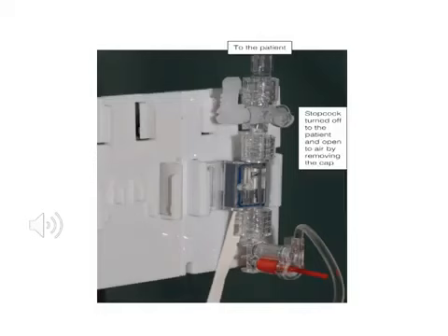Hemodynamic monitoring system. Again, this is more clear. This is the white stopcock. Notice we close it to the patient and open it to the atmosphere, and we even remove the cap of the cannula to make it zero level. After that, through this red bulb we can do the fast flush, and later on we make sure we have done zeroing of the readings. We make sure whether the system is optimized or not through the square wave that we talked about earlier.